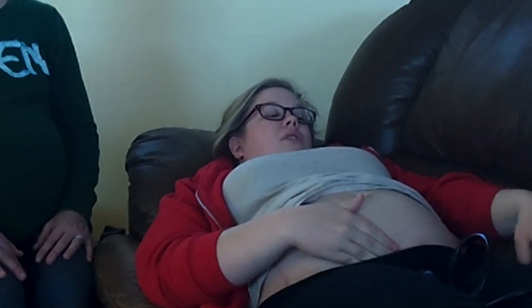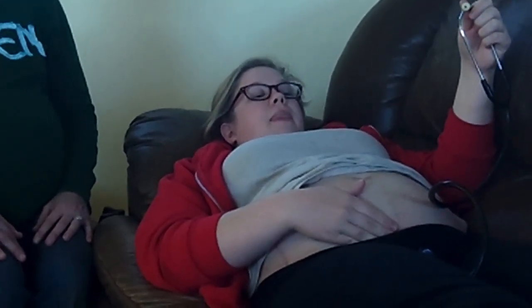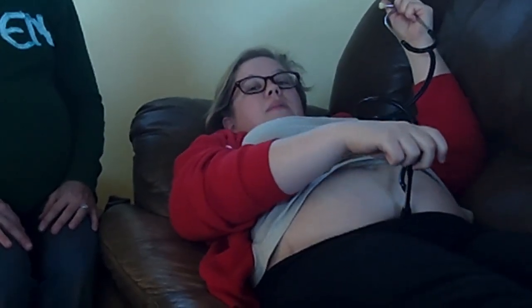So again, when we're really early and we're listening, so sort of like when we're feeling early in pregnancy, you're feeling really, really low. And the same sort of goes for when we're trying to listen. So when I am going to start listening here in a moment, I'm going to put this side of the fetoscope really low on my belly.